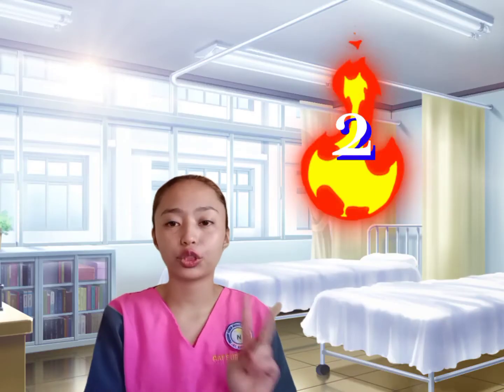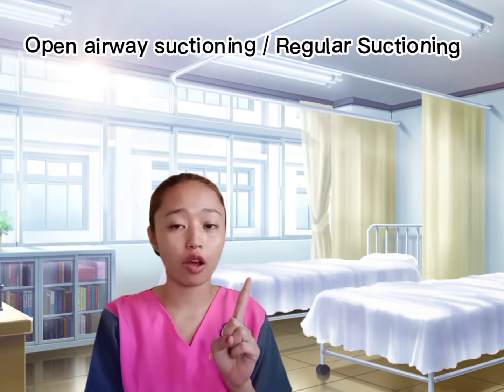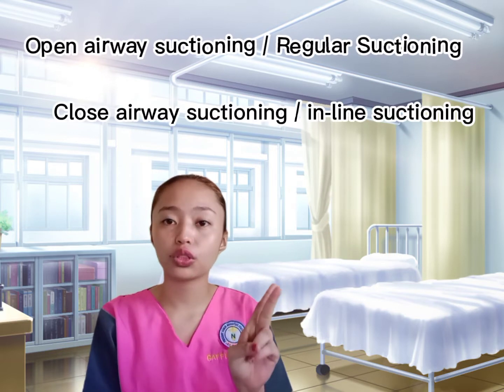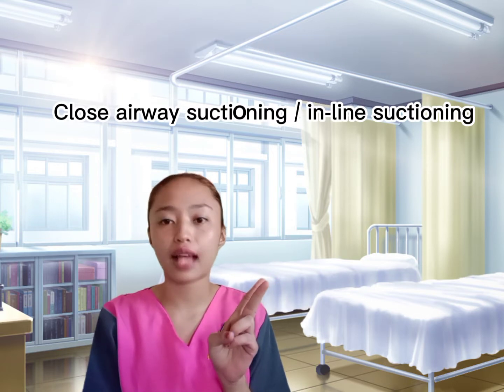Note that there are two methods of suctioning. One is the open airway suctioning, or the open method. Two is the closed airway suctioning, commonly known as inline suctioning.